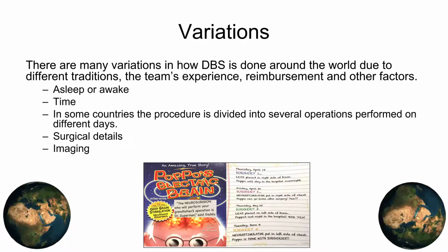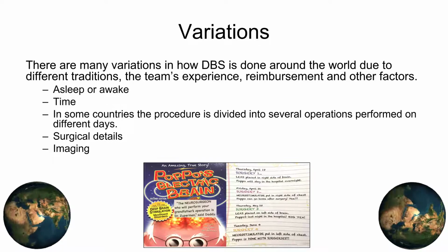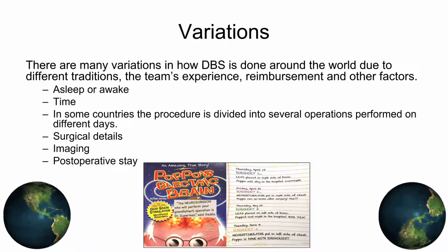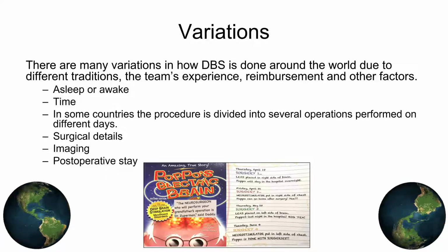The imaging can be done in various ways, and not everyone will verify after surgery that the electrodes have ended up where intended. And the postoperative stay might vary, and some will discharge a patient to their home on the day after surgery.